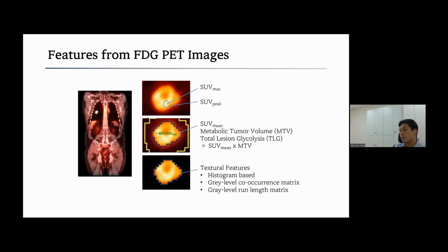Further validation is warranted for the future clinical use of FDG-PET findings and this kind of radiomics or other data analysis fields as important prognostic factors.